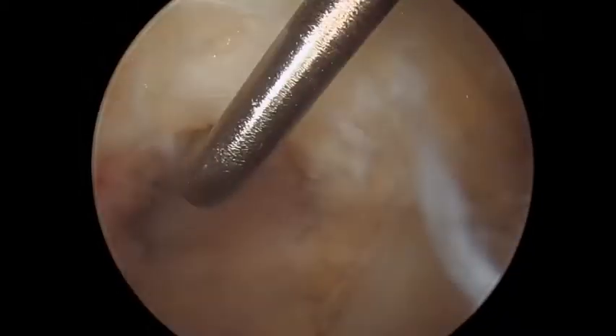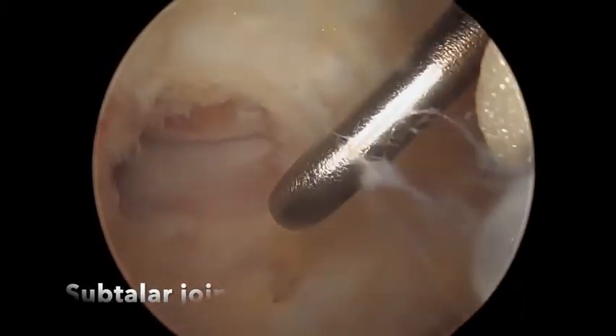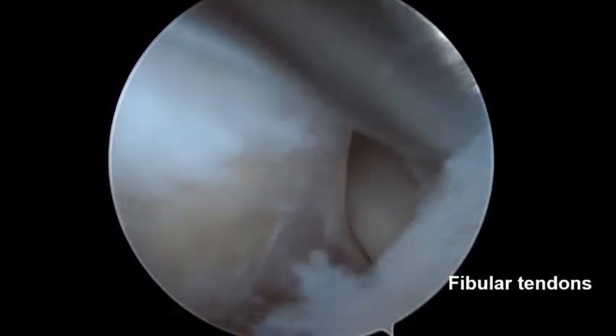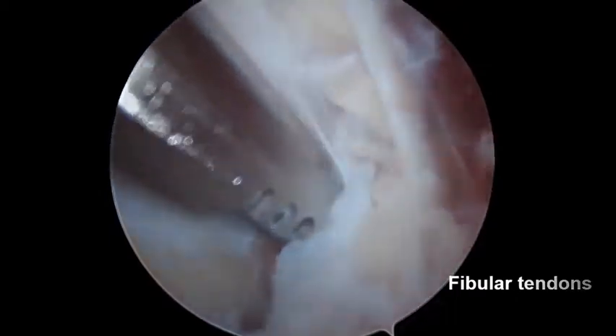Continuing dissection inferiorly, the subtalar joint is visualized, and posteriorly are the fibular tendons. The CFL can be identified using the fibular tendons as reference, as its fibers run adjacent to the tendons. From this point, the CFL fibers can be followed superiorly to its fibular attachment.